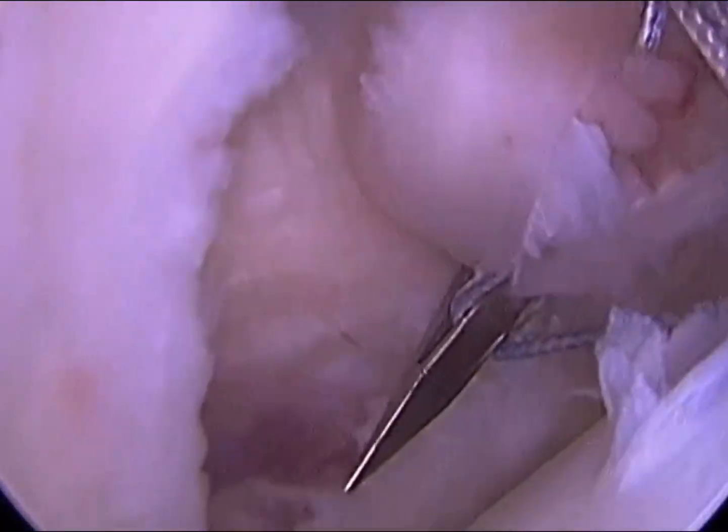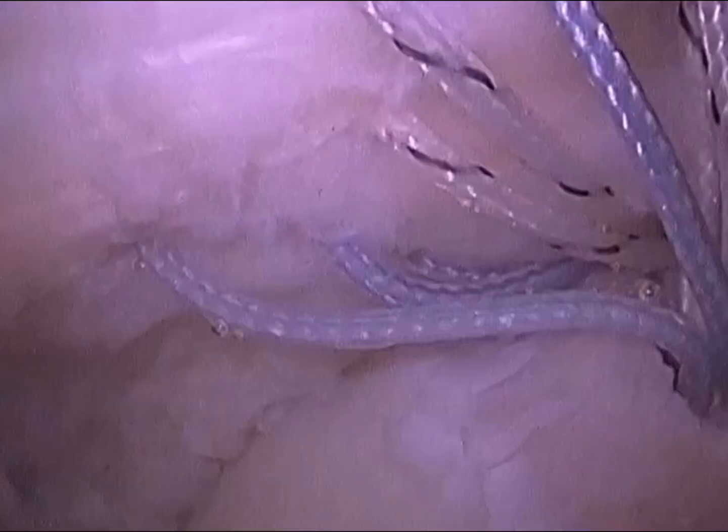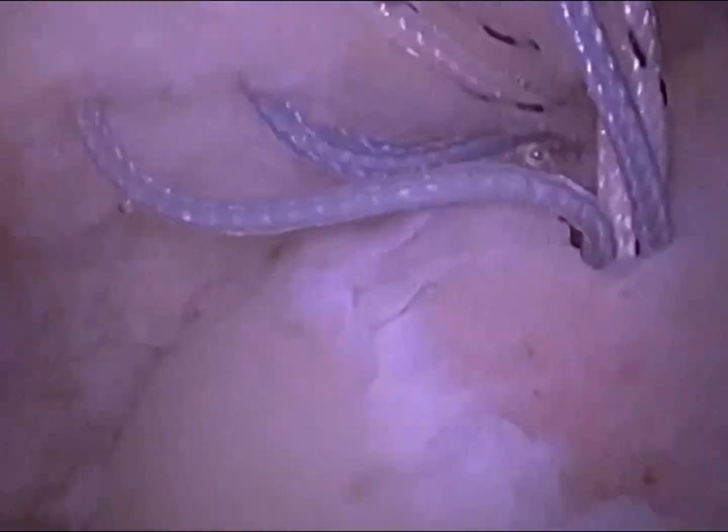I have placed a 2.7 mm suture anchor containing 2 threads at the lesser tuberosity after preparing the bed with the shaver and burr. Then you can secure the suture by passing it through the subscapularis tendon, and after that you can go for the sliding knot to secure the subscapularis. And this is the final picture after the repair of the subscapularis.